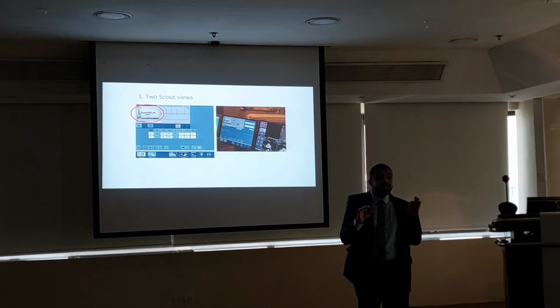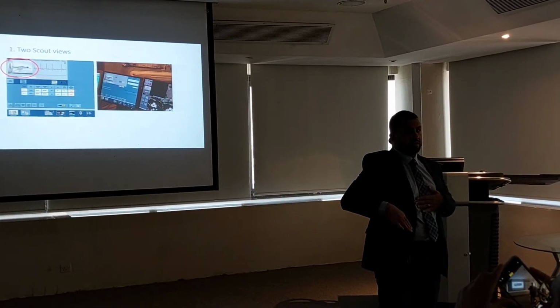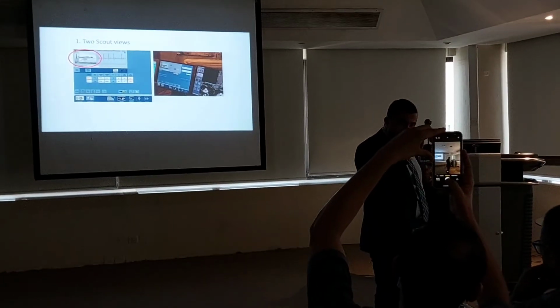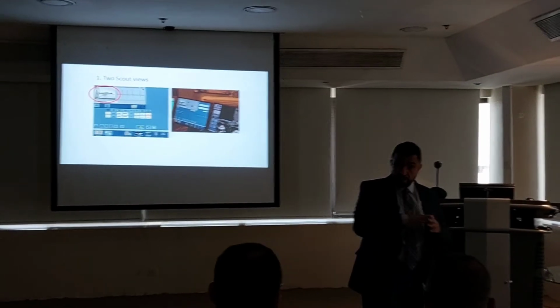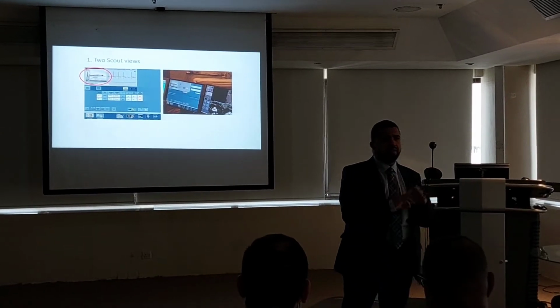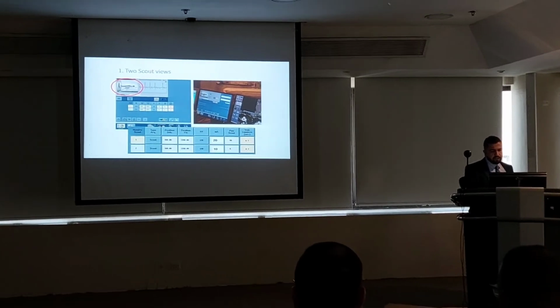You are positioning well from the anatomical reference, sternal notch, and the table height and isocenter. And the patient's heart is always not in the mid body, it's in the anterior chest. So consider this. It's applicable in all CT procedures. The better the isocenter, the better the quality. But in cardiac especially, it's more critical to get the heart at the isocenter. Okay? Good. Two scouts, lateral and AP, and then we are ready.